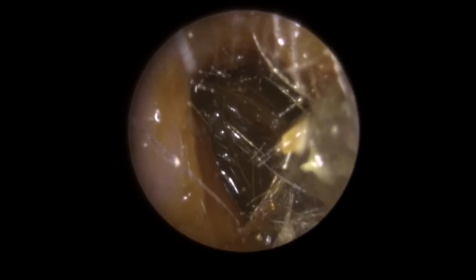So you can see same kind of issue on this second ear. Very thick sticky wax here at the entrance to the canal, and just starting to maneuver this section of wax. You can put a little bit of olive oil in here already, so you can see the olive oil there to the left hand side of that block of wax. Really trying to budge this out.